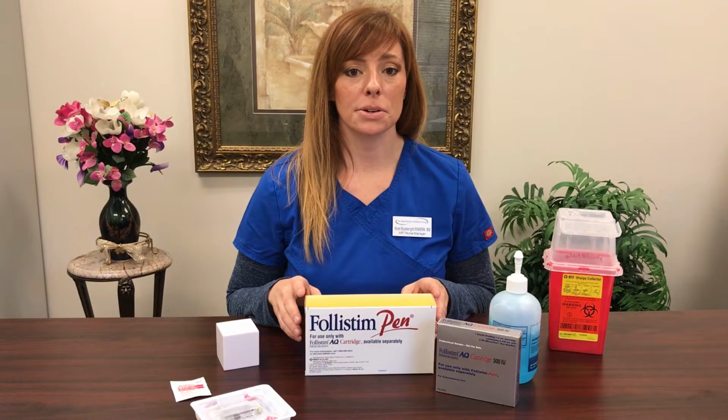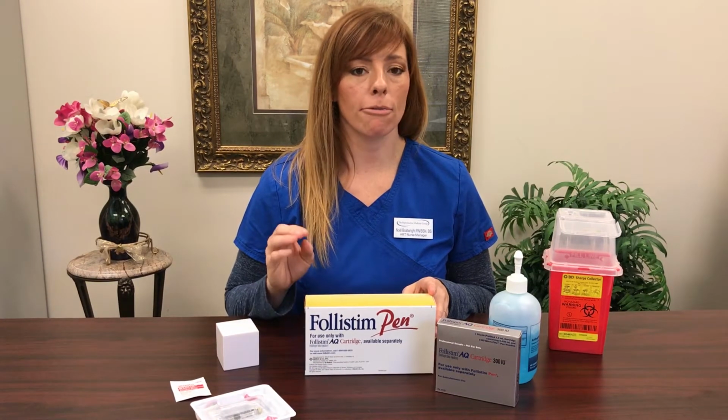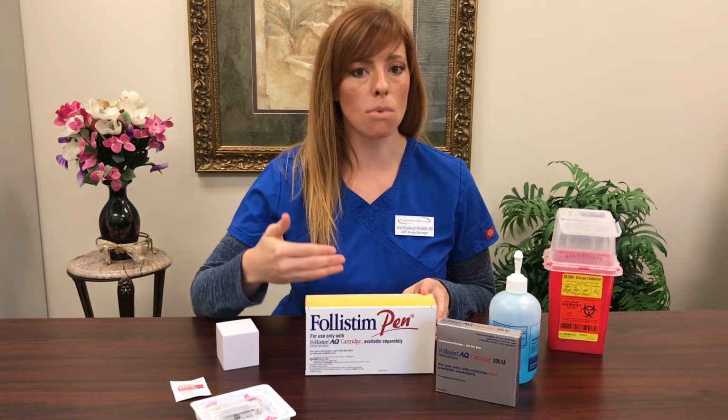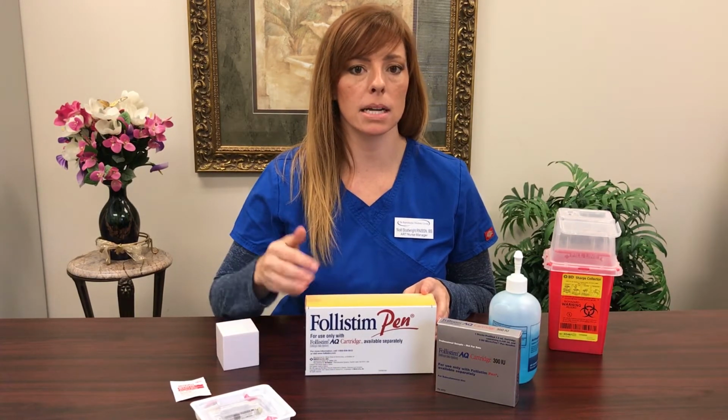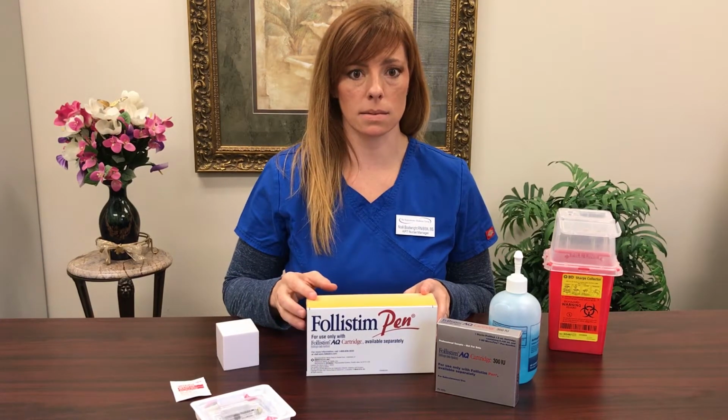Today we're going to learn how to use your Follistim pen. Follistim is a brand name for a hormone that your body naturally produces. However, we're going to give you more in your IVF cycle than your body would be able to produce because we're wanting to retrieve as many eggs as possible.